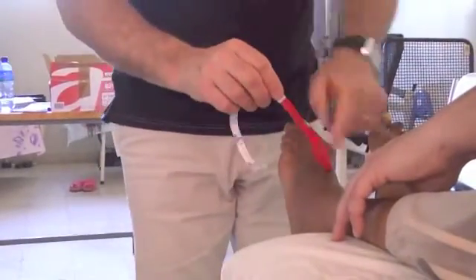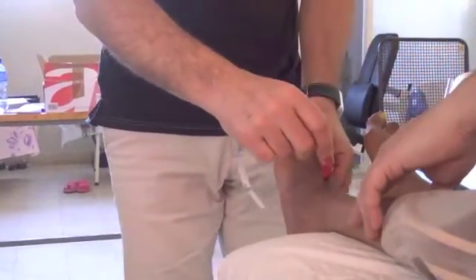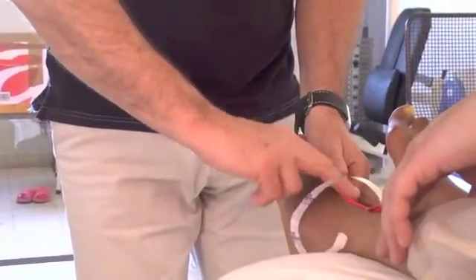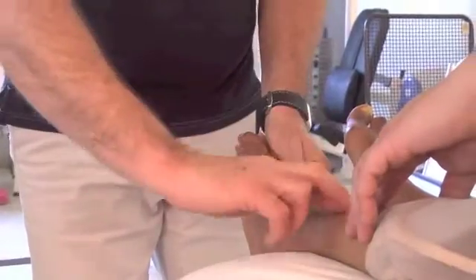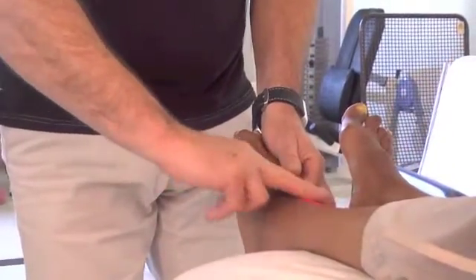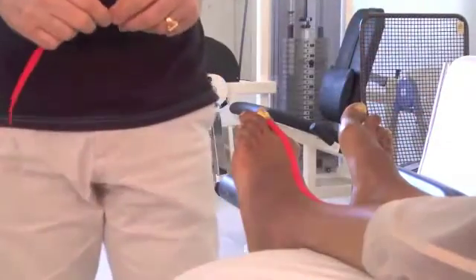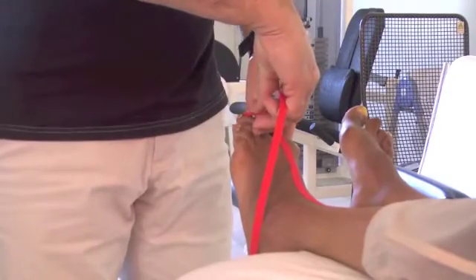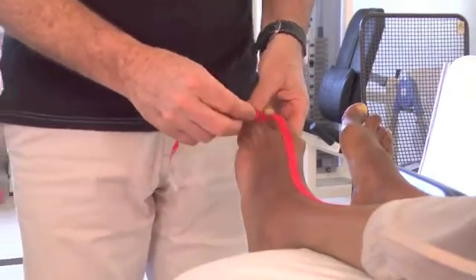And then again, we're going to go towards lateral of the tibia, which means we're going to stretch down and apply the tape. So here we're going to put at the base of the toe. We have to try and create some stretch. We have some rigidity.